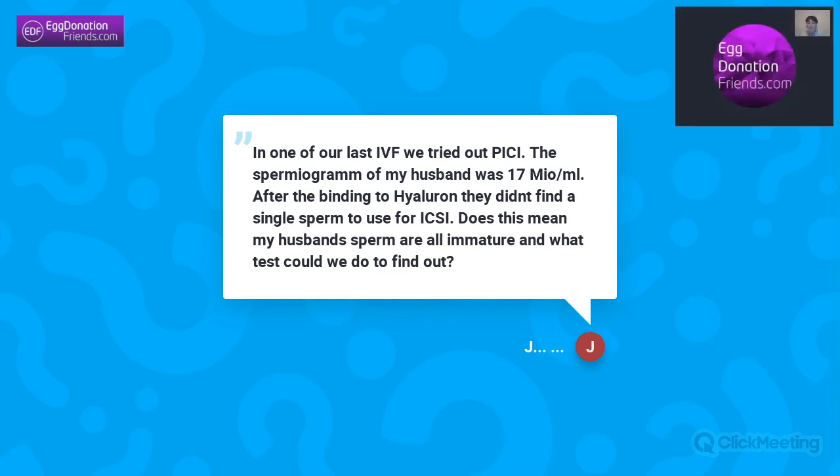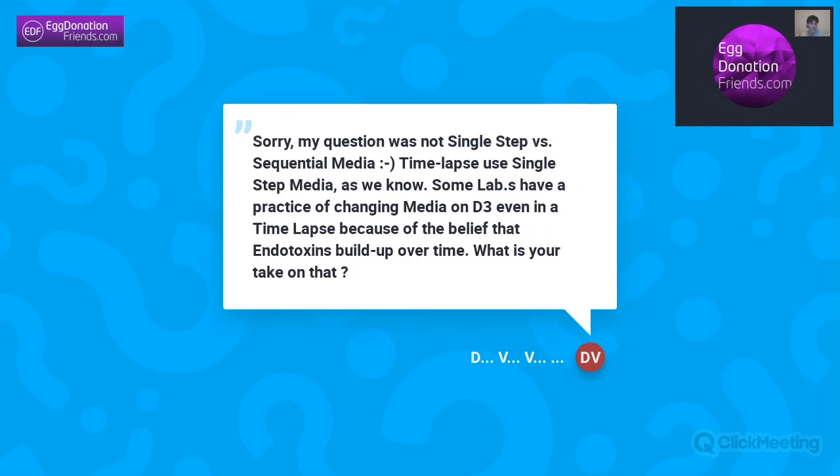And we also have the follow-up question to the one which we had. So if you have any additional comments on that. Sorry, my question was not single step versus sequential media. Time-lapse uses single step media, as we know. Some labs have a practice of changing media on day three, even in a time-lapse, because of the belief that endotoxins build up over time. What is your take on that?